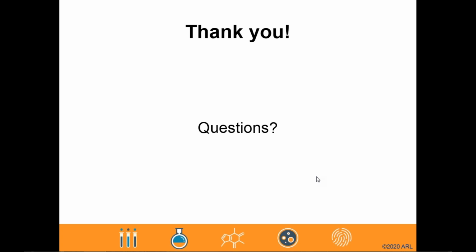Another question, why is including stressed organisms important during the validation? Yeah, I can speak to that. I touched on that slightly during the webinar presentation. If one thinks about likely potential contaminants in a compounded product, generally speaking, they're not going to be in their healthy or growth phase, and they would be stressed or, quote, injured based on perhaps the pH of the product, the temperature at which it was shipped or stored. So again, to reiterate, recovery of stressed or injured microorganisms is going to be much more representative of anything that may be present in a sample to be tested for sterility.